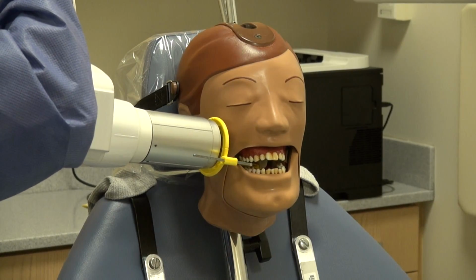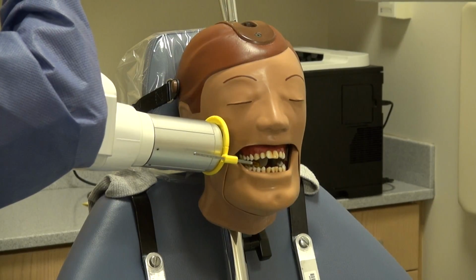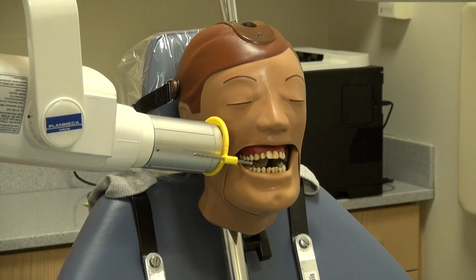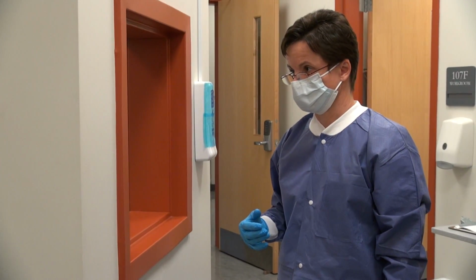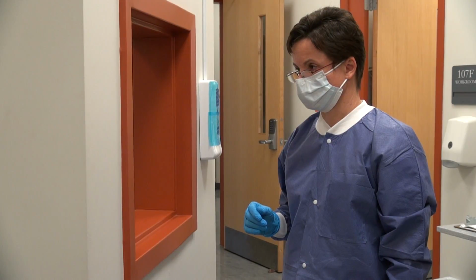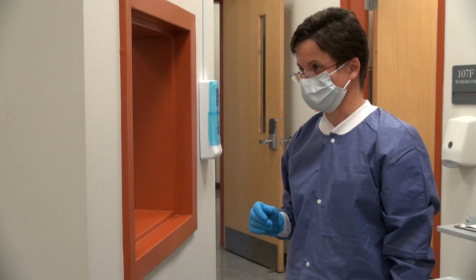Make sure that all is parallel, and then go and push the button quickly, as again, this image can cause the gag reflex. Always look at your patient before making the exposure to make sure that they haven't gagged or moved in any way, and make sure that the tube head is not moving during the exposure.